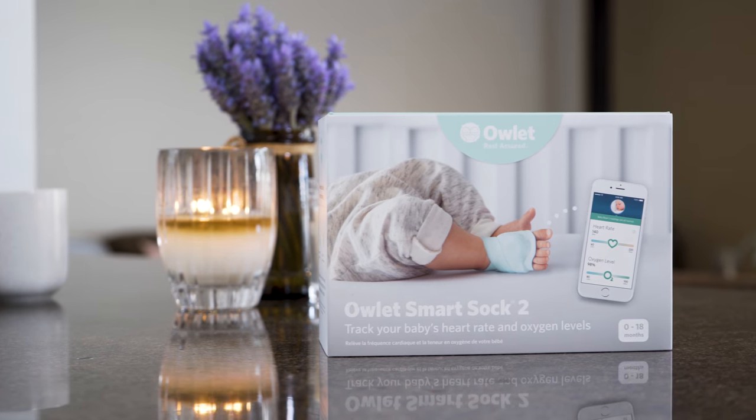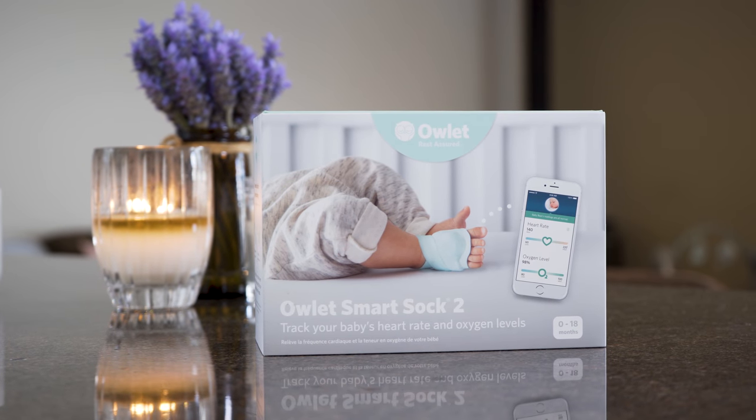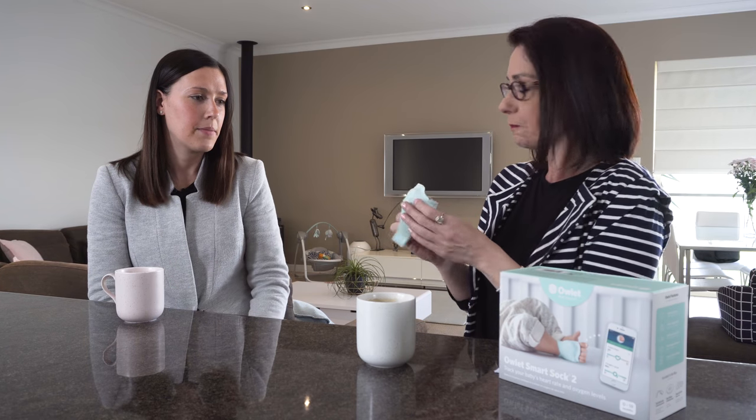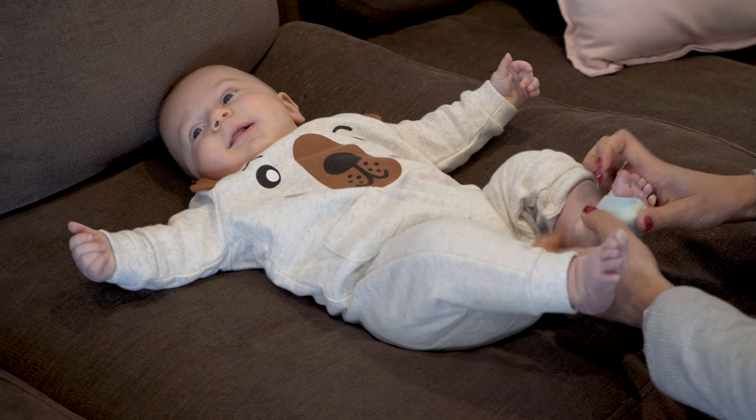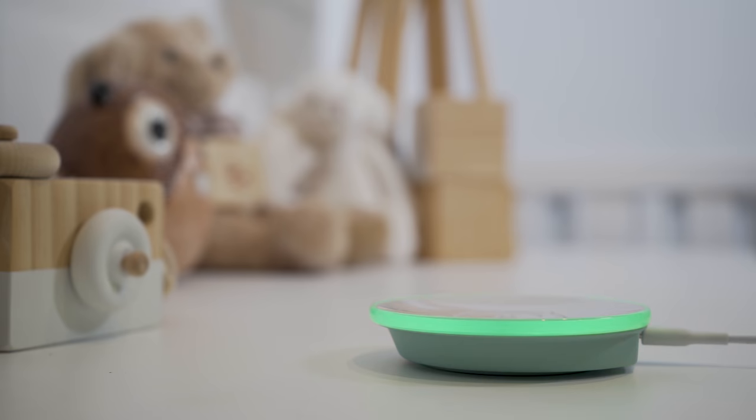So when the product arrived, tell me a little bit about what it's made up of and how you set it up. Basically you just open it up — it came with three different size socks and depending on the size of the foot, I tried them on, worked out which one was best, then grabbed the base station, set it all up. The instructions are really easy to follow and I linked it all to my phone and away we went.